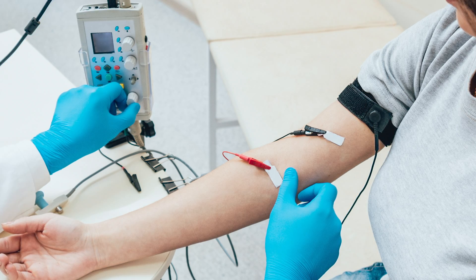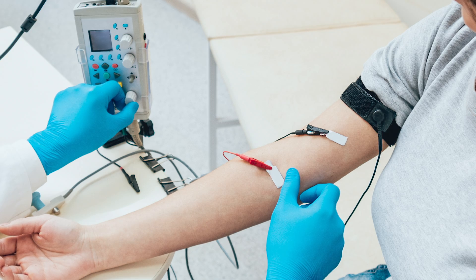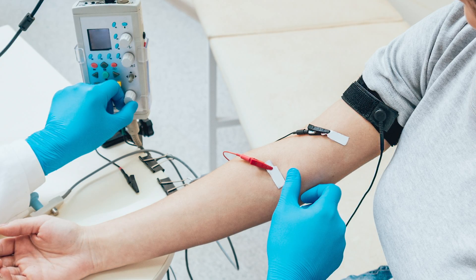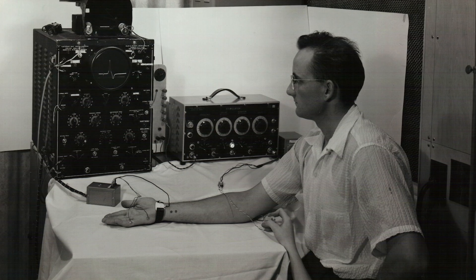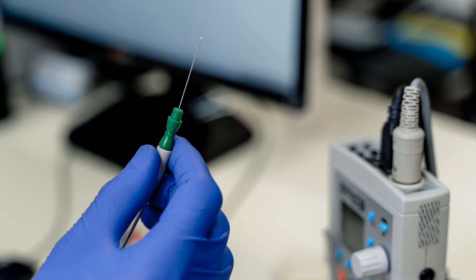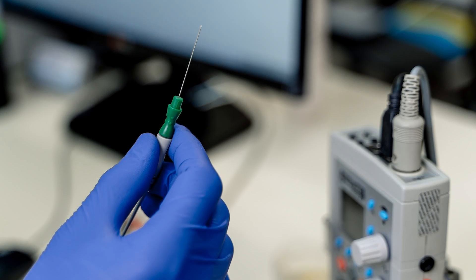Different types of EMGs measure this electrical activity in different ways. The most common type is a surface EMG, which uses adhesive electrodes on the skin connected to a monitor to measure the difference in voltage between the two electrodes. This style is more appropriate on superficial muscles, like those on someone's hypothenar mass. There are also inserted EMGs, which use a needle or wire stuck into the skin, letting the user analyze deeper or more delicate muscles that might be overpowered by bulkier muscles during surface EMGs.